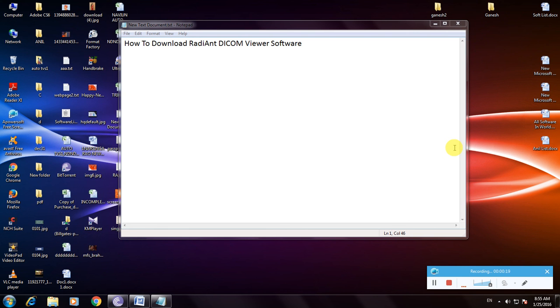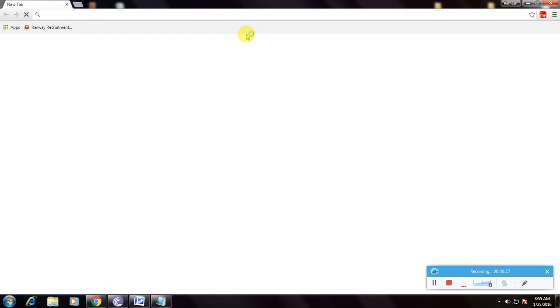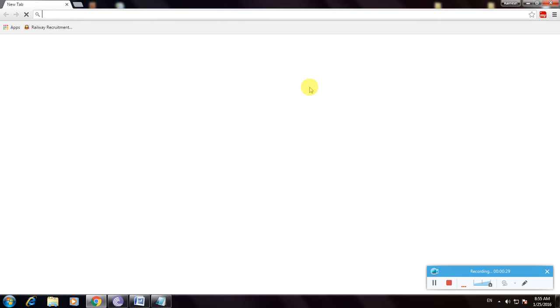First, we need internet and a web browser. I'm using Google Chrome. So this is Google Chrome. Now go to the Google home page.